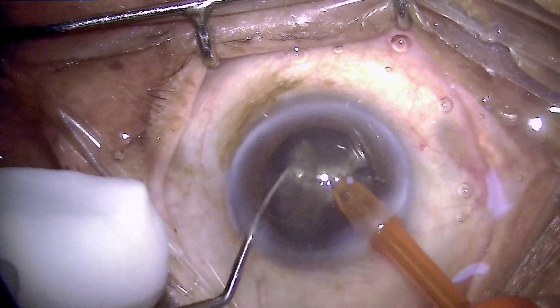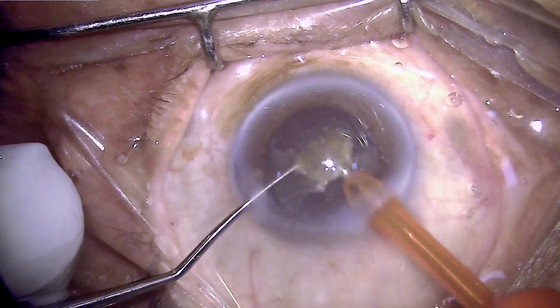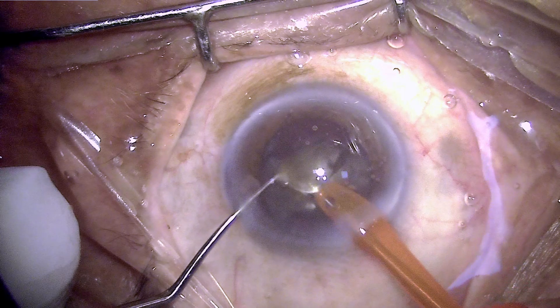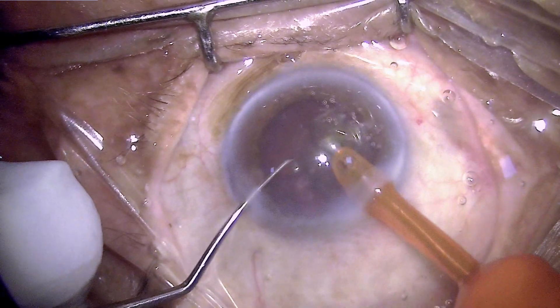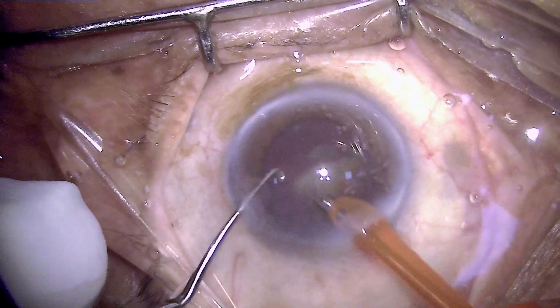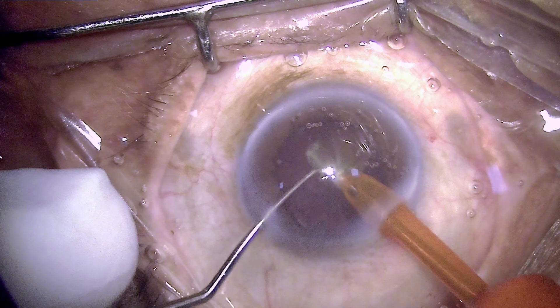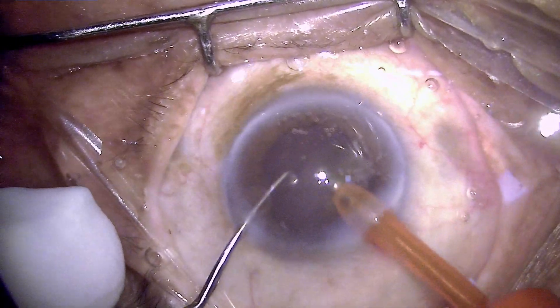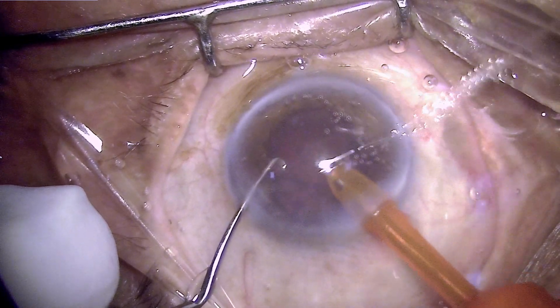Instead of emulsifying the quadrants directly, I am chopping them further into smaller pieces, and these pieces will occupy less volume. They will protrude less into the anterior chamber and as a result will not touch the endothelium, which I have experienced is the major reason for post-operative corneal decompensation and keratitis.